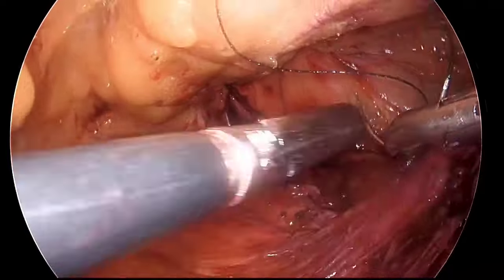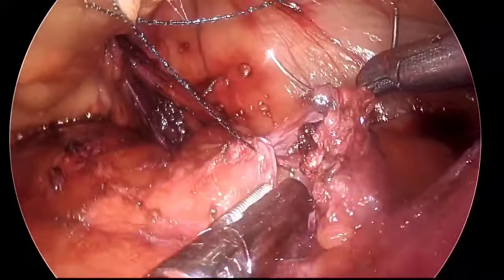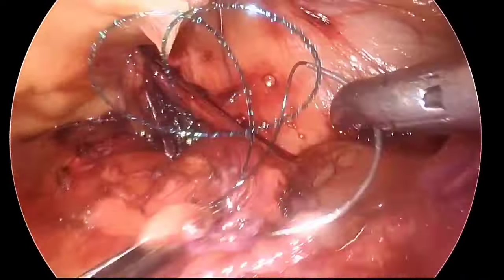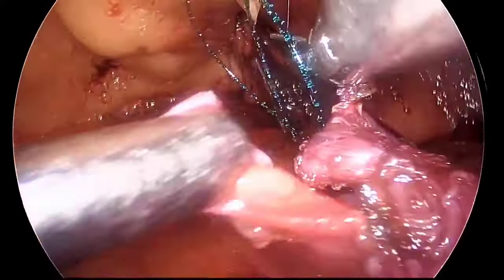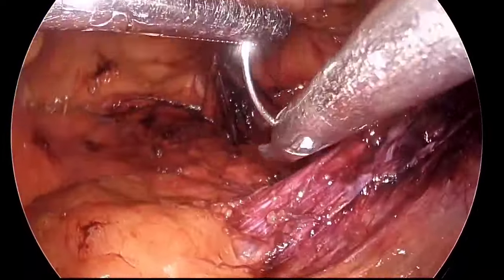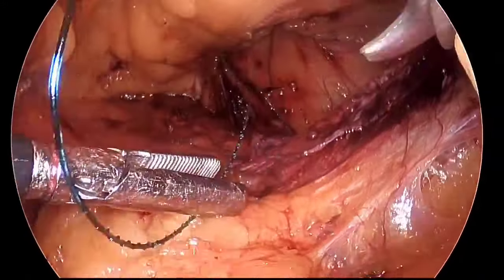Because you are creating enough space below the umbilicus, even if you have made a rent in the peritoneum, you won't lose as much space as we tend to lose in a general TEP approach. That is the idea of choosing eTEP repair for this large inguinoscrotal hernia.